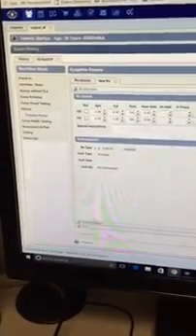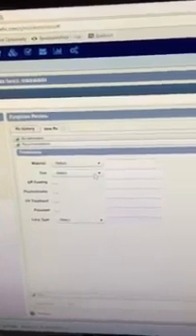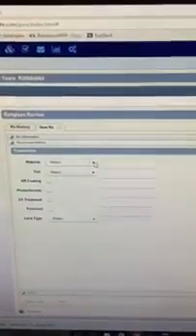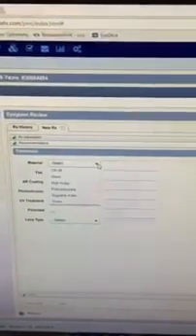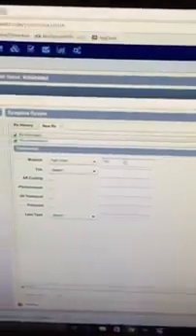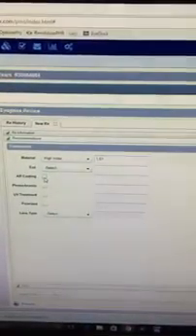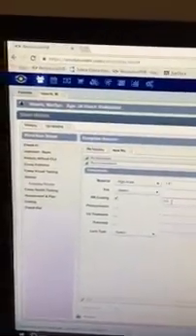And then if you go down to the slider under recommendations, right here, hit on that slider. You can choose what you want to prescribe the patient. This is really important because the optician will look at this page in the final prescription screen that she sees on her end to see what you want. Just say that I chose high index and I wanted 1.67, no tint, but an AR, and say you want Unity Elite AR.